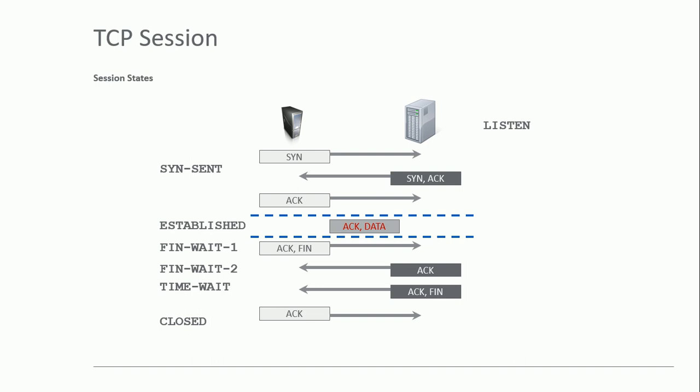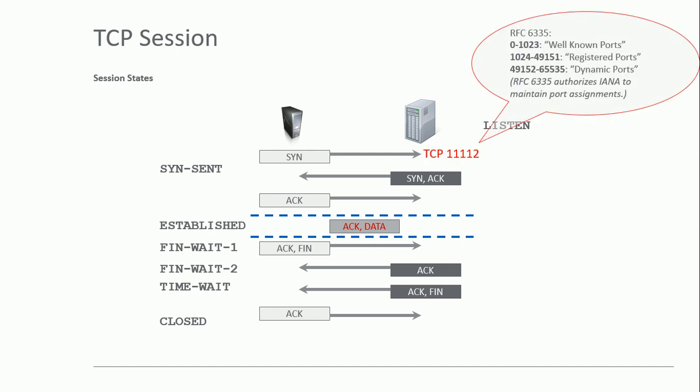That all happens so fast. It's very ephemeral. So you're not going to see those statuses very often. You might catch one when you run the netstat command, but generally we're not looking for those when we're troubleshooting or when we're running that netstat command. But it's good to understand what the process here is in the connection.